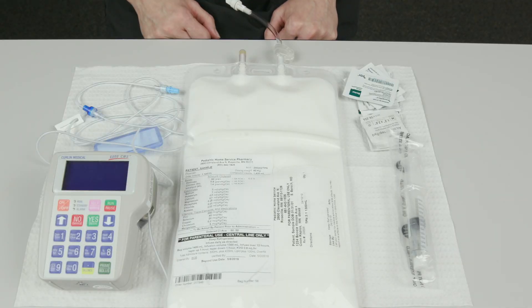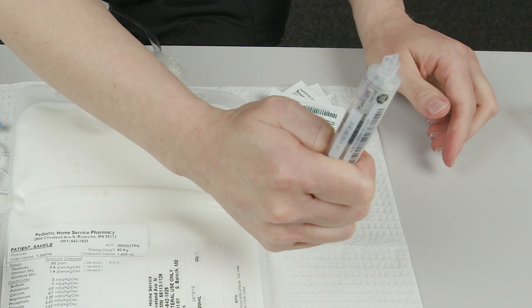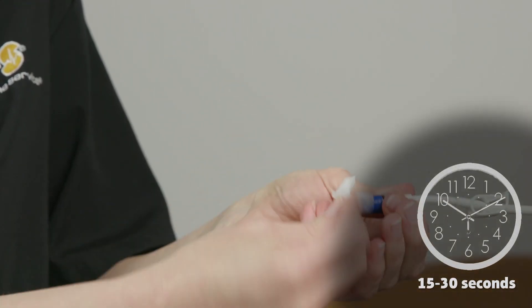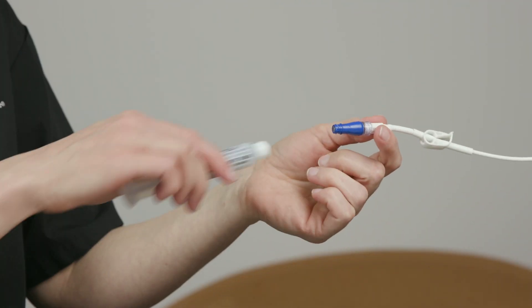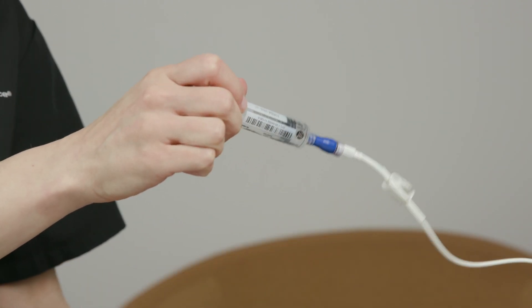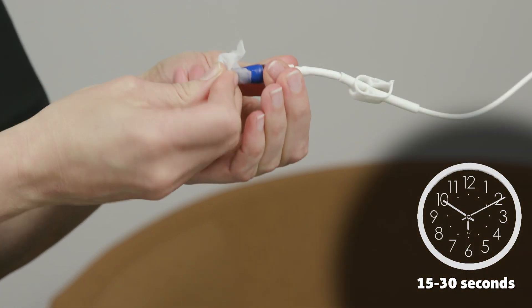Before you start the HPN infusion, flush the IV catheter with saline. To prepare the saline flush syringe, remove the cap and lay it on the safe zone with the open end toward the ceiling. Push up gently on the plunger to remove any air from the syringe. Carefully put the cap back onto the tip of the syringe. Scrub the hub of the needleless connector on the IV catheter with a chlorhexidine pad for 15 to 30 seconds. Allow the connector to air dry. Attach the syringe to the hub of the needleless connector. Open the clamp on the IV catheter. Use the push-pause method to slowly push the fluid from the syringe into the IV catheter. Hold on to the needleless connector and remove the syringe. Scrub the hub of the needleless connector again with a new chlorhexidine pad for 15 to 30 seconds. Allow the hub to air dry.